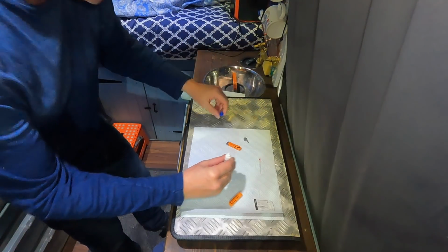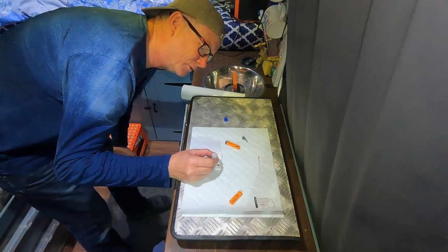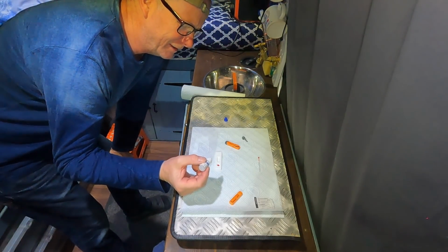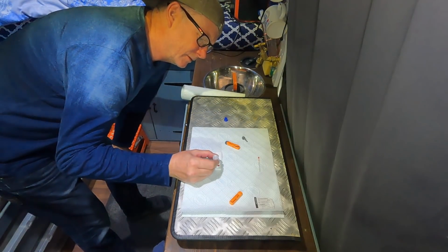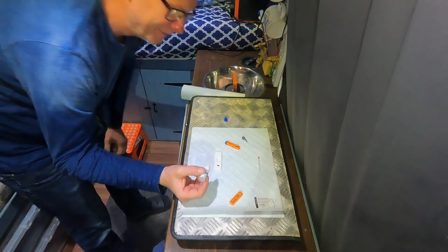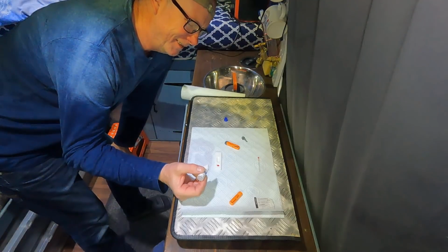Now I've got to put 4 drops of this in. It does say wait 30 seconds, so I'll need to put 4 drops of this in, precisely 4 drops. There's one. It says wait 2 or 3 seconds between drops. 2. I can see why it's soaking in. 3. It's a disaster.